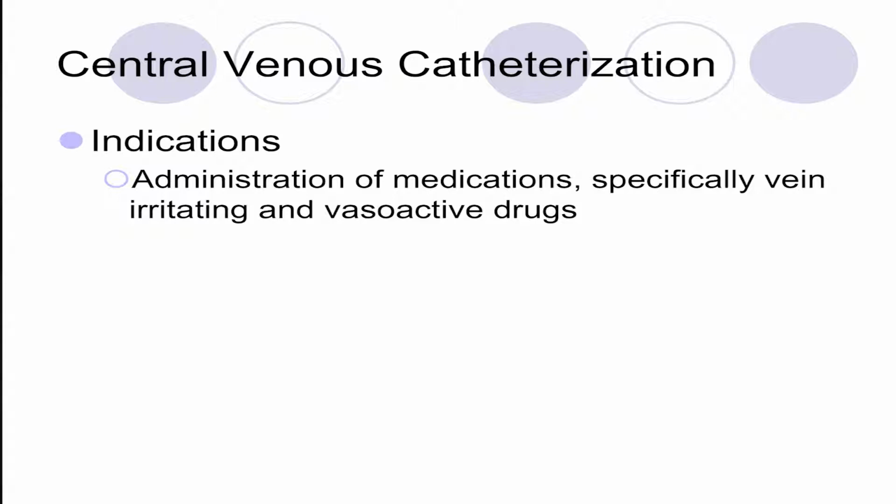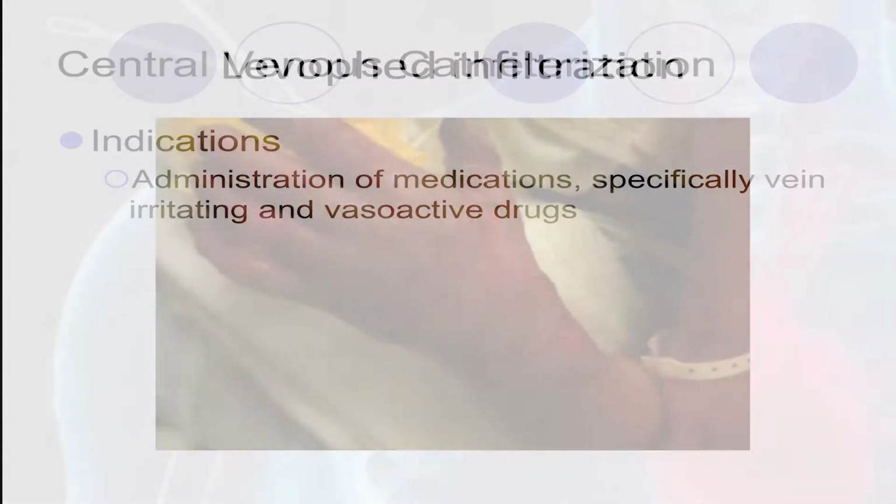The reason being, this is a little lady that we had come in. She presented to an outside facility in Swanee, septic, got 2 liters of fluid resuscitation, failed to respond and was started on Levophed through a 20-gauge IV in her forearm. Life Force was called. They picked her up. They did an assessment there. Everything is good. Lift off. Less than a 20-minute flight time, so total looking at IVs about 24 minutes. When she arrived here, the site was red and the IV was infiltrated. Levophed was into the tissue space.